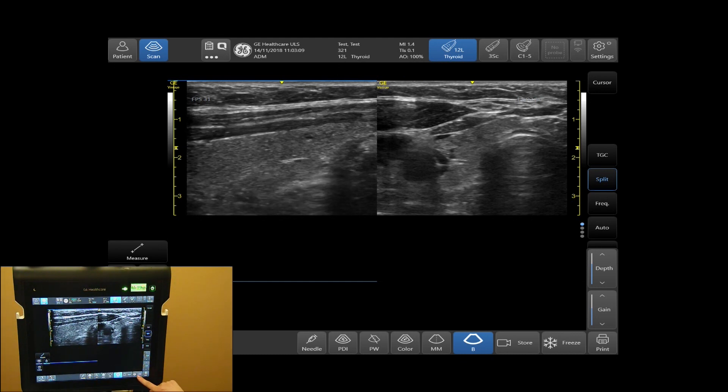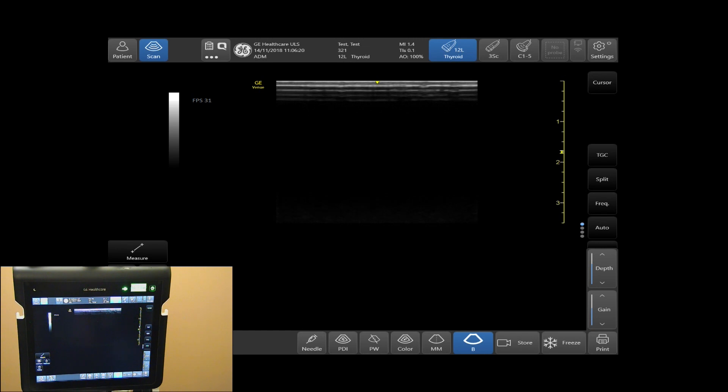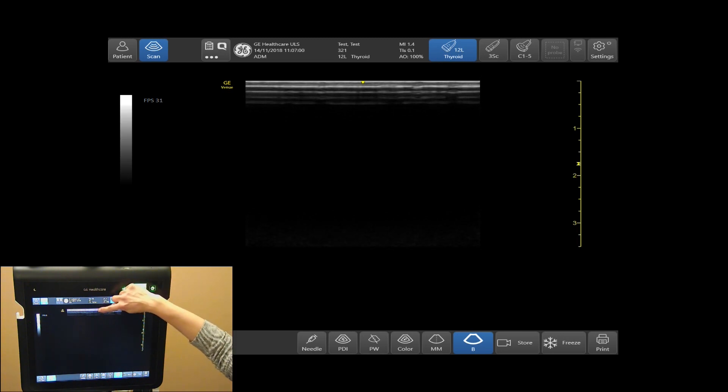Simply hit Freeze and you can store your image. The full screen tab located on the bottom left-hand side of your touch screen will allow you to increase your image size. By activating this feature, you will minimize your function and imaging parameter tabs on the side panels of your touch screen. To activate your centerline, simply tap the yellow arrow displayed on top of your image. Tap and release will activate and deactivate this feature.